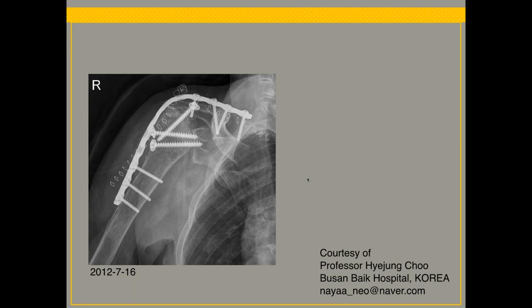Well, I would have to conclude that they got rid of the infection. Otherwise, they couldn't do this. Yeah. So why not just put a new shoulder in or something? But the way this was handled, I'm not sure. Right. I sure would like to get a good history on this. Okay. Presumably, they felt there's too much damage to be able to do a shoulder replacement, but we don't know. Well, a shoulder replacement with an infection is probably worse than trying this. Okay.